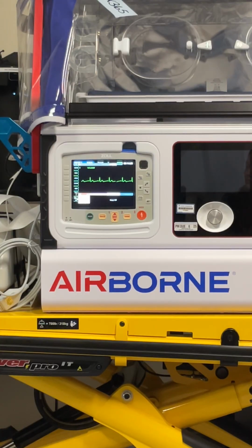A lot of times it's like, what time do we leave? But that's not part of the report. If this says 6:52 and you wrote 6:54, it's not part of the chart. Don't worry about that, it's just to try and help you. And if you print it out, your documentation is in the event review. It is in there.